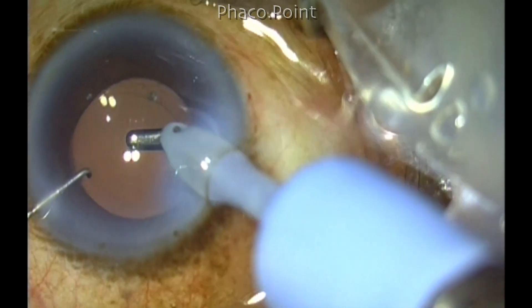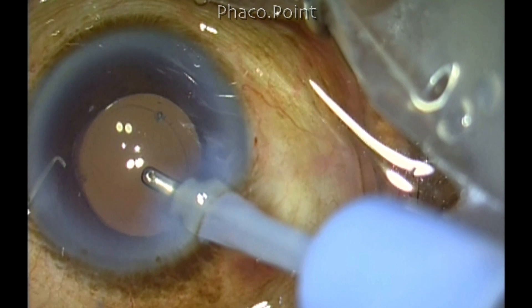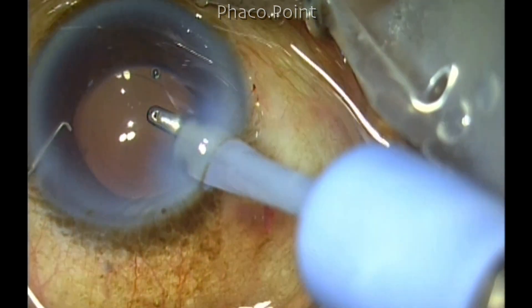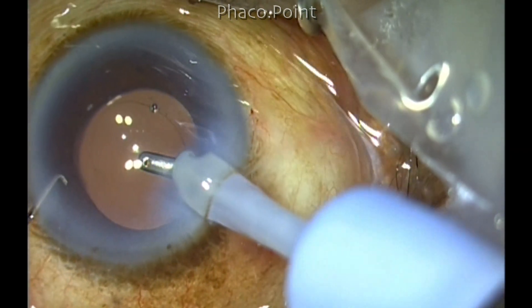Now you see how beautifully the intraocular lens is centered and you have a rhexis that's completely overlapping the optic. This will definitely give a good predictable refractive outcome and also reduce the incidence of posterior capsular opacification.